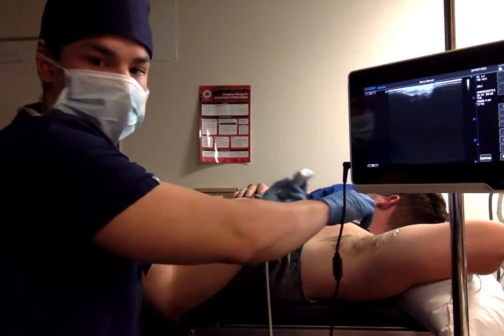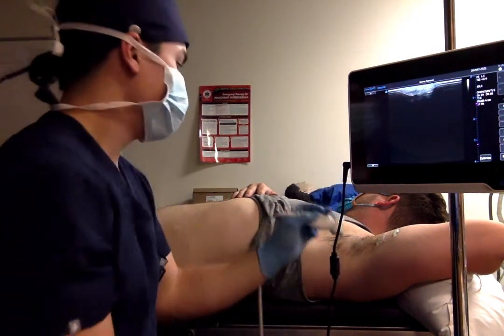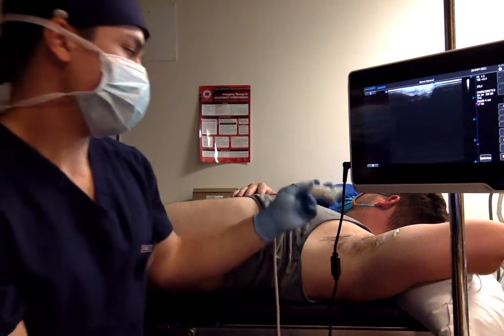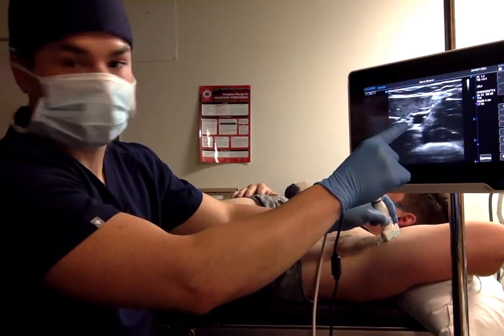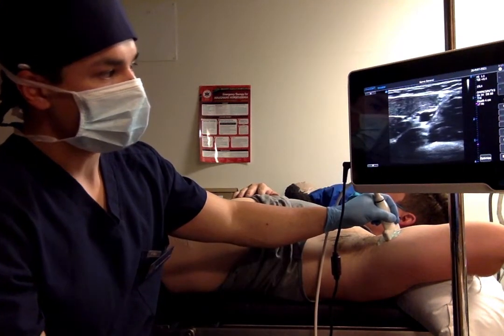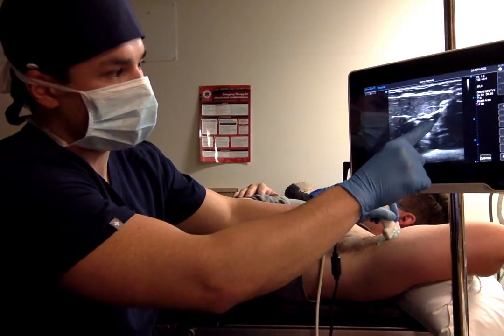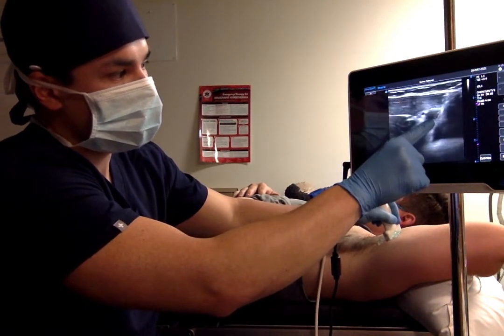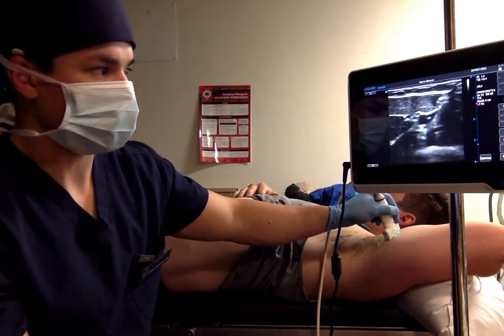Apply some gel to my site. And then with the axillary block, like I said, it's a highly vascular area. So we're looking for the axillary artery right here in the center. That's pulsatile. We know that the veins are easily occluded, so we want to make sure to avoid those structures.